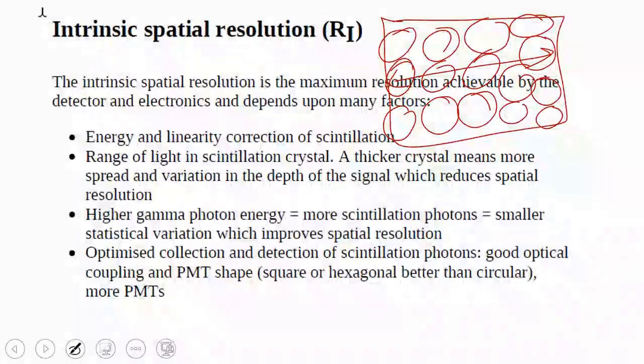If there is variation, adjustments need to be made. It should be set so that the value comes out to a certain amount. Then it starts to adjust the values between the points of the crystal, making them all linear with each other. It ensures that all the photomultiplier tubes and all the crystals see the source equally. If there is a difference, it will affect the intrinsic spatial resolution of the crystal itself.